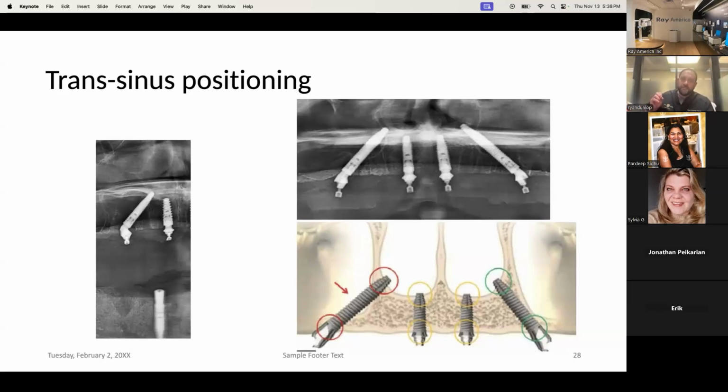So when I have very avascular type 1 dense bone that doesn't really bleed, then I will go back and prep more and try to get the implant to seat somewhere between 30 to 50 Newton centimeters. But every other case, from all maxillary implants to pterygoids and zygomatics, we are routinely putting implants in at 90 Newton centimeters plus. Good question.